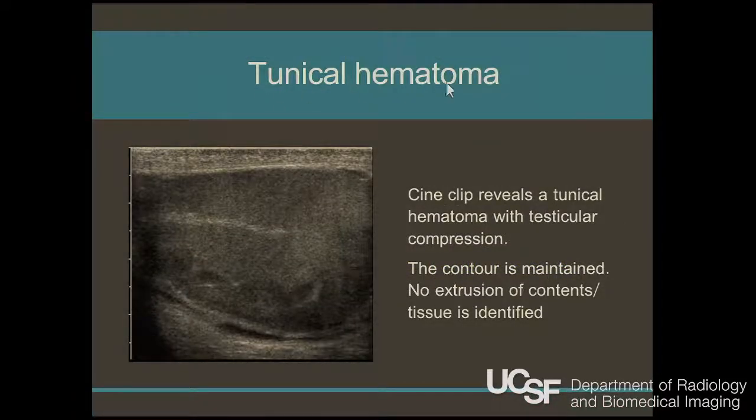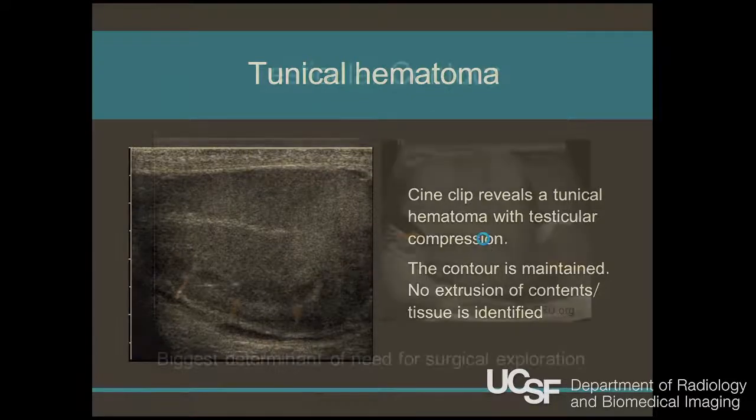So this is a tunical hematoma. So here's the tunica, this bright echogenic line around the testicle. Here's normal testicle parenchyma, and this is a hematoma in the subtunical region compressing the testicular parenchyma.